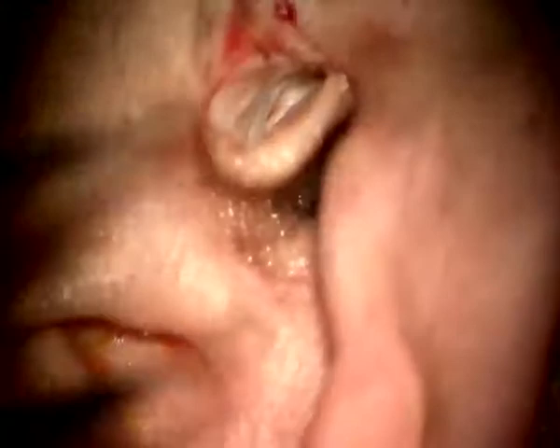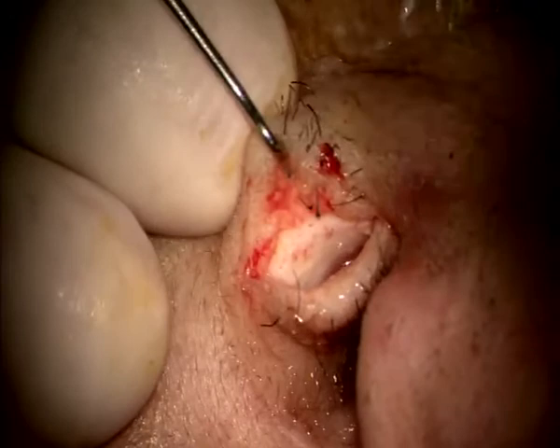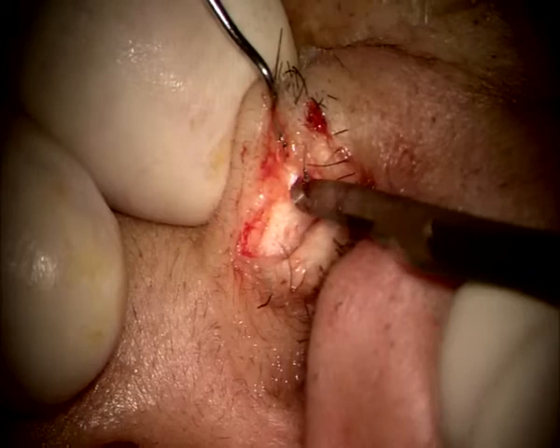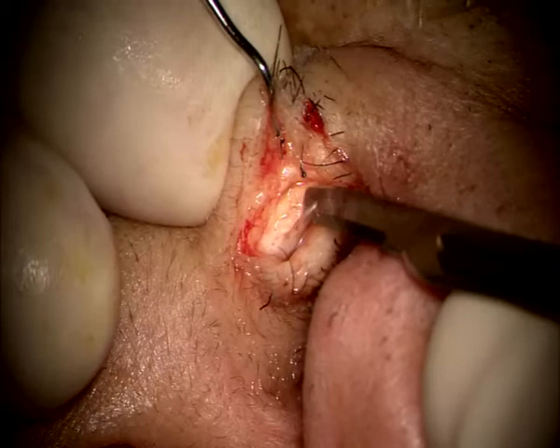Take this. Give me the knife, please. Knife back. Yeah, knife. Feel the edge, and the edge is here, so you could go up a bit more, gain more. And you make a cut to the cartilage. And then elevate. Add some. Yes.